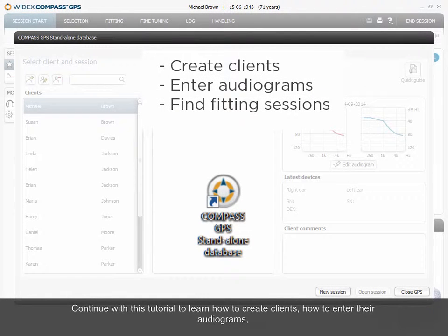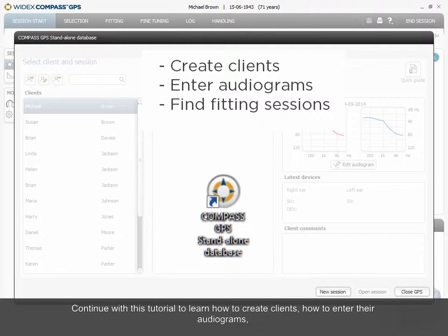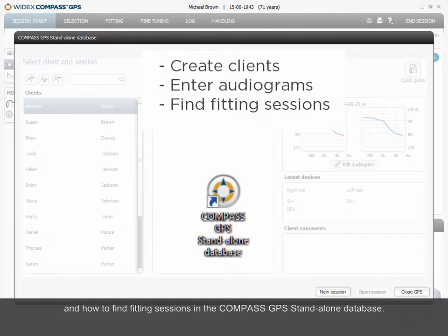Continue this tutorial to learn how to create clients, how to enter their audiograms, and how to find fitting sessions in the Compass GPS Standalone Database.